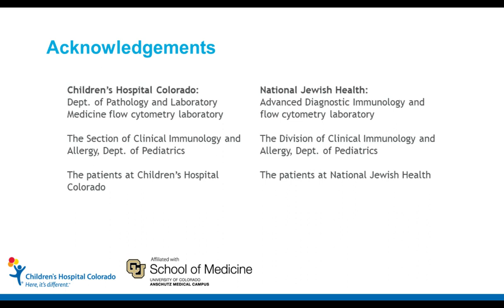Thank you, Alexis. That is a really important question. One of our first line laboratory diagnostic tests is the TBNK analysis, which detects T cells, B cells, and NK cells. As we've seen in the presentation, when we take the example of a failed TREC screen and analyze a baby sample as a follow-up, we may actually detect T cells. So does it necessarily rule out immune deficiency? Not necessarily, because these T cells could be of maternal origin. They could be memory T cells. They could be functionally impaired.